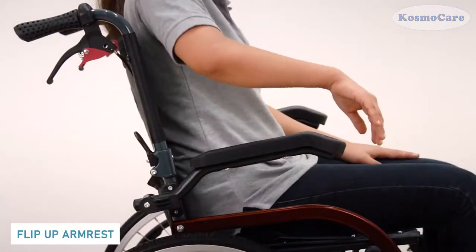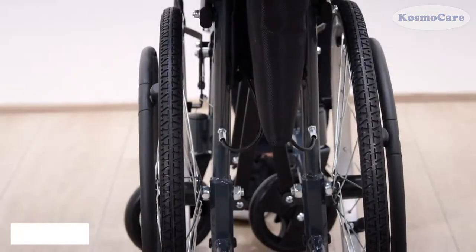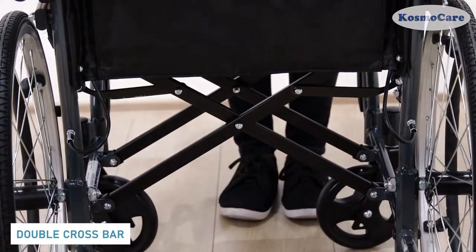Flip-up PU armrests are extremely durable and allow for an easy transfer to and from the bed. The double cross bar adds extra strength to the wheelchair.